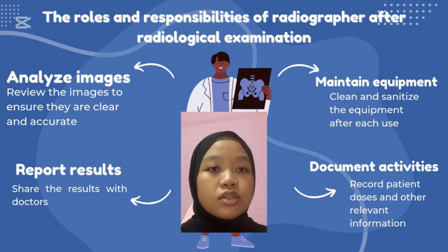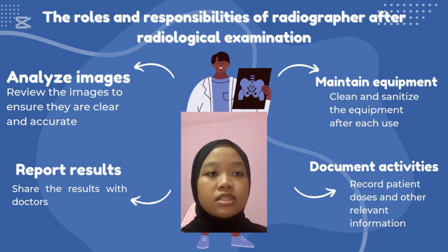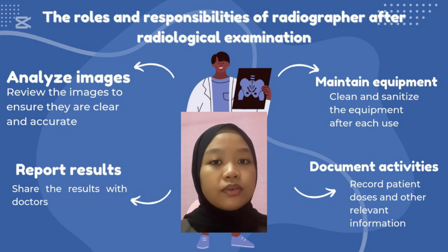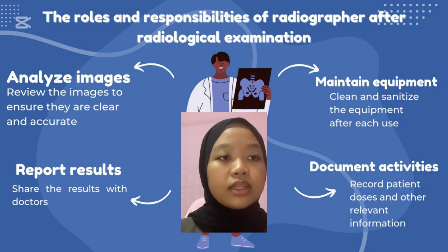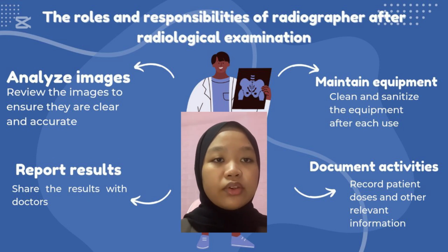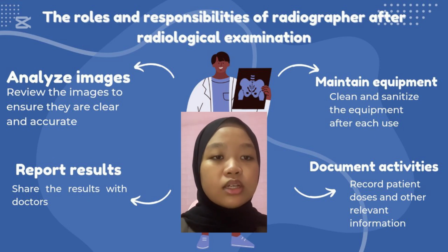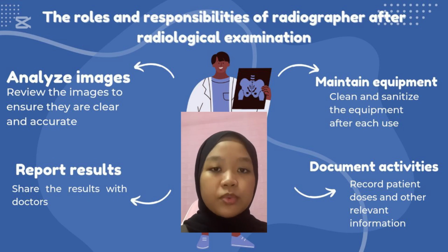Equipment maintenance is also essential. After each exam, the radiographer cleans and sanitizes the imaging equipment to maintain hygiene and functionality. Finally, documenting all activities is important for maintaining accurate records such as patient doses and other relevant information, which ensures that there is a complete and accurate history of the procedure.